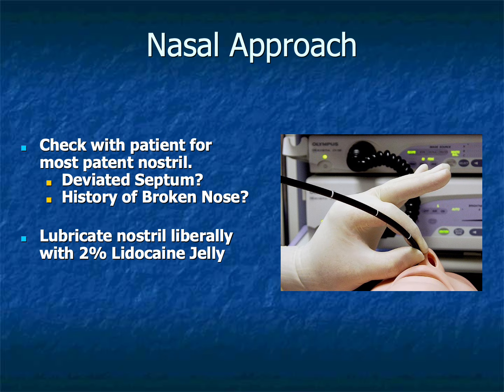Airway entry begins with preparation. When using the nasal approach, understanding patient anatomy matters. A deviated septum, prior fracture, or narrowed passage may influence both comfort and procedural success. Generous lubrication with topical anesthetic helps reduce resistance and patient discomfort.